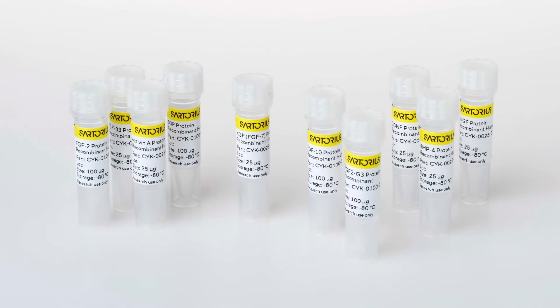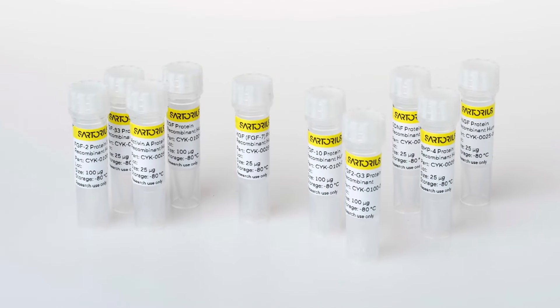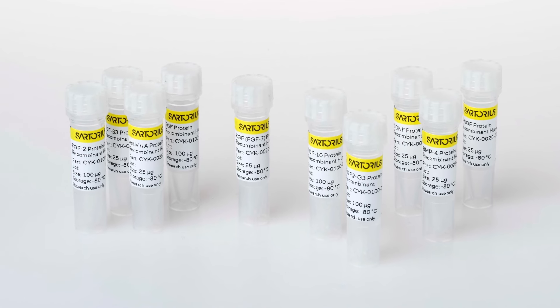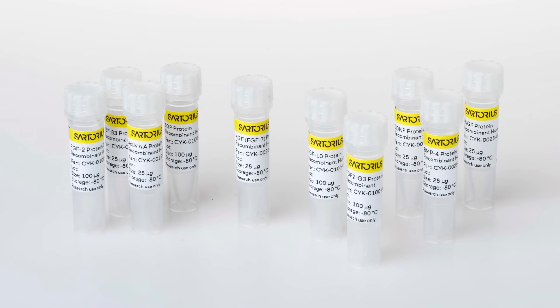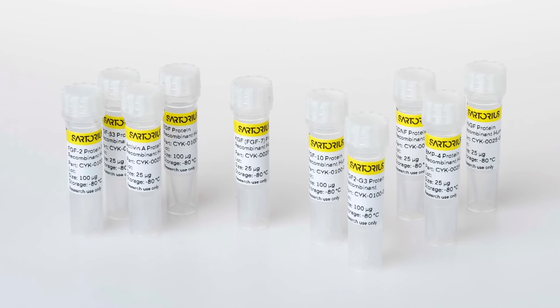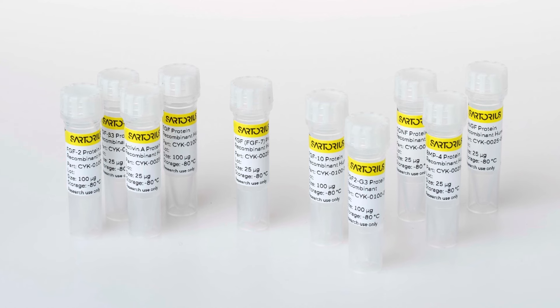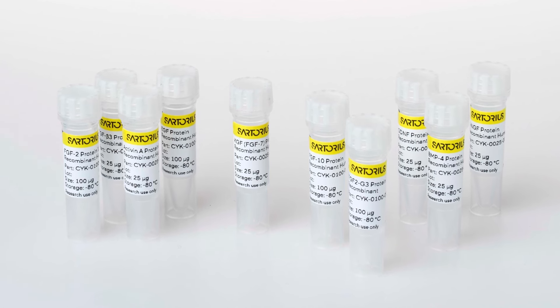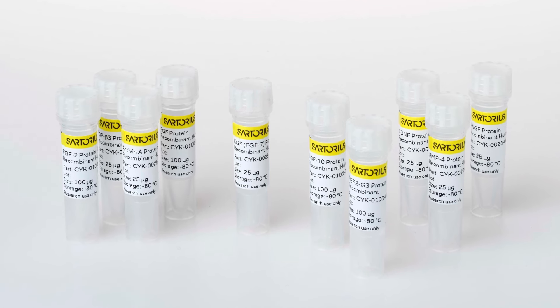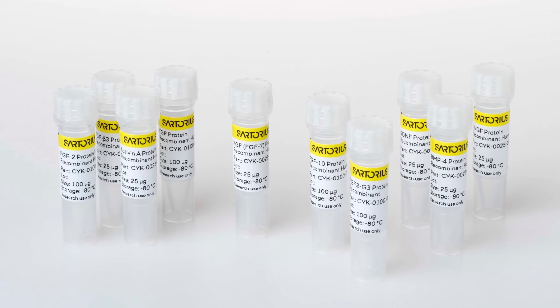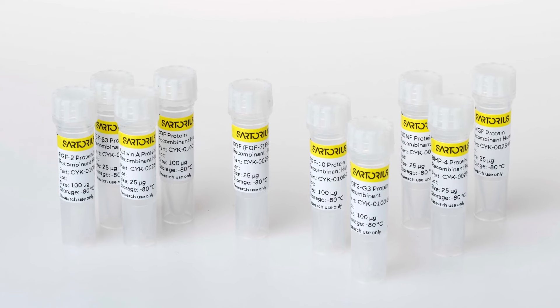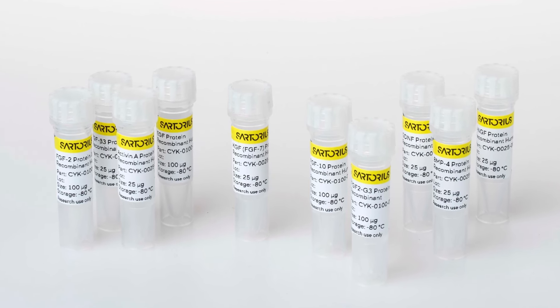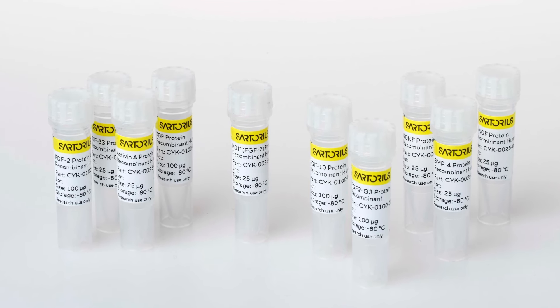Sartorius provides a suite of solutions for the challenges researchers face when developing iPSCs and organoids such as commercial media and research use only growth factors and cytokines, while also providing the means to monitor and analyze critical cell and 3D cultures in a non-perturbing manner using the Incucyte live cell analysis system.